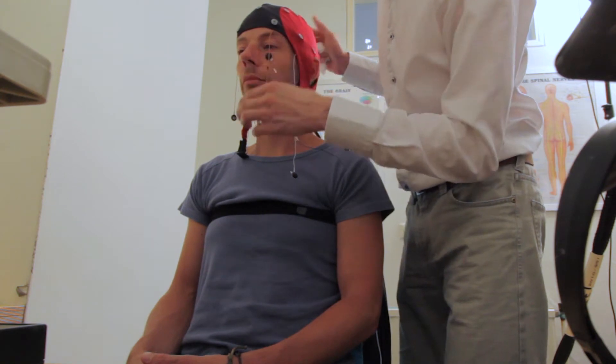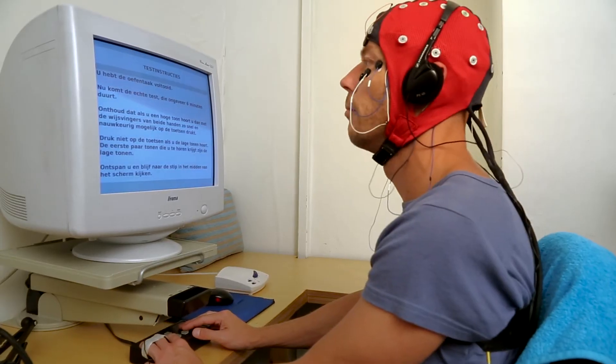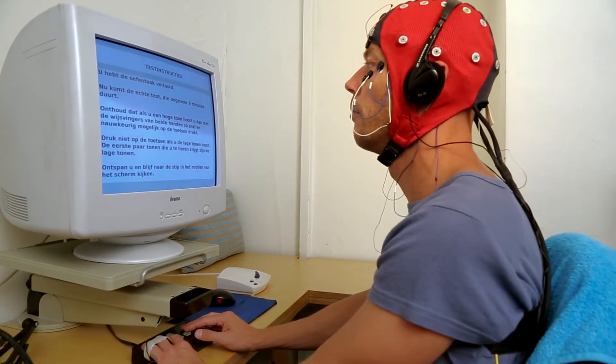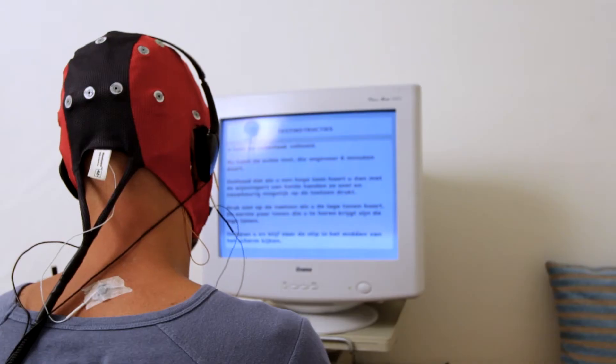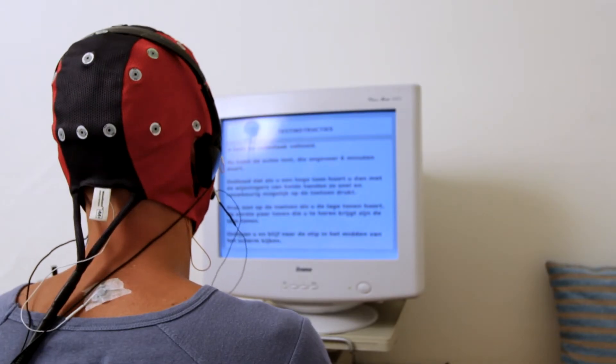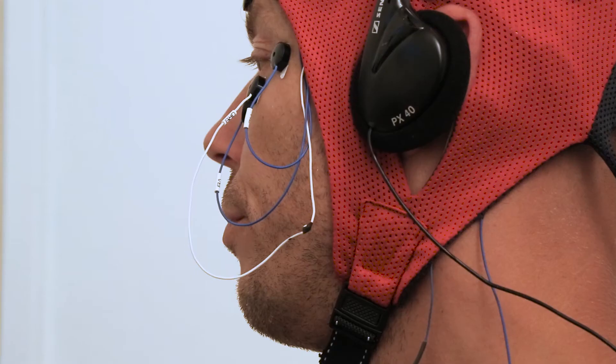Among other things, these electrodes measure eye movements and muscle tension. When everything is properly connected, the QEEG assessment begins.